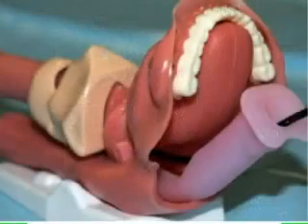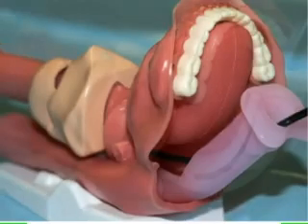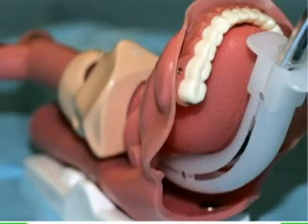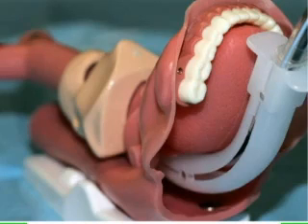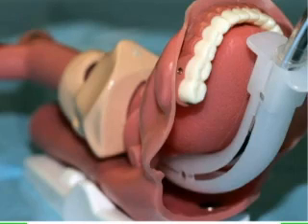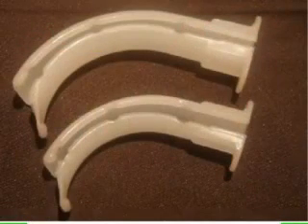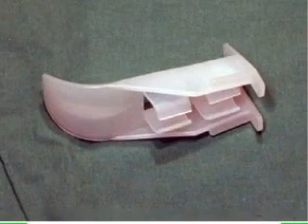Various oral intubating airways can also be used during fiber optic intubation. These may help to keep the bronchoscope in the midline and align it with the glottic opening, displace the tongue anteriorly and the soft palate superiorly, thus opening the pharyngeal space and protecting the scope from bite damage. These include the Berman intubating pharyngeal airway, the Williams airway intubator, and the Ovassapian fiber optic intubating airway.